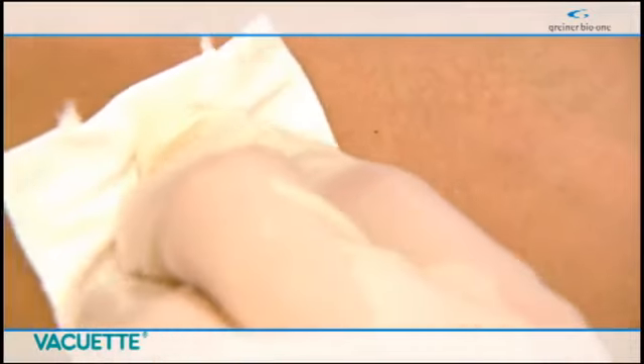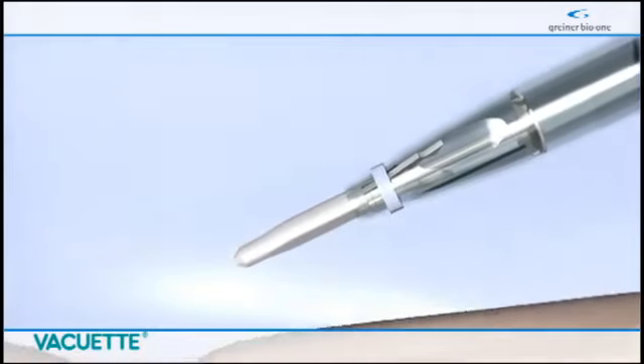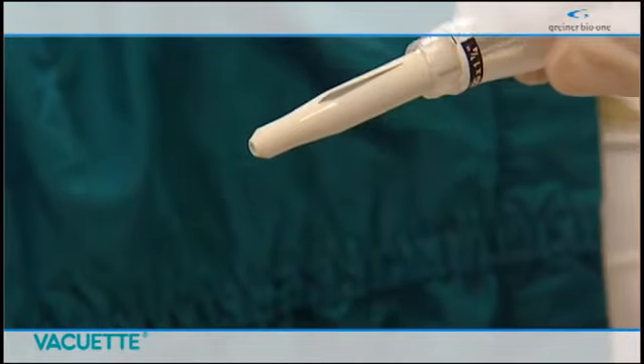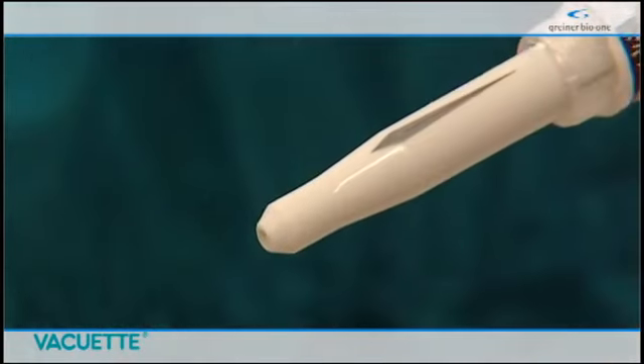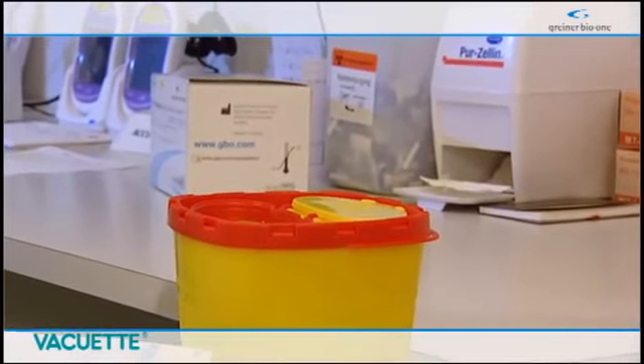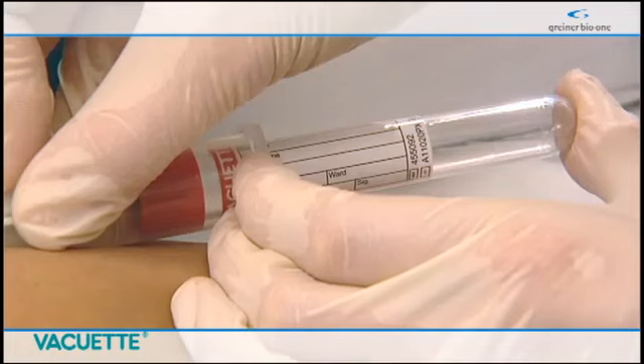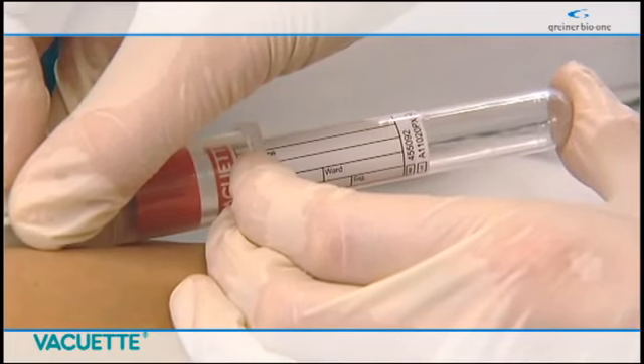Upon completing the patient specimen collection, terminate the venipuncture by removing the needle from the vein and placing a sterile gauze over the puncture site. As the needle is removed from the vein, the protective shield automatically covers the needle, eliminating any chance of a needle stick injury. The Premium Safety Needle System can easily be disposed of in a suitable sharps disposal container.